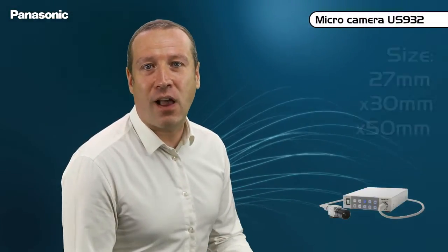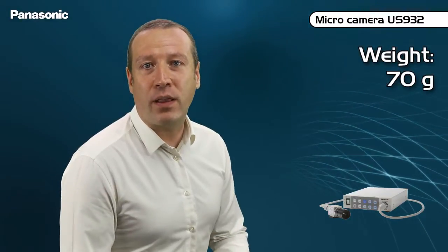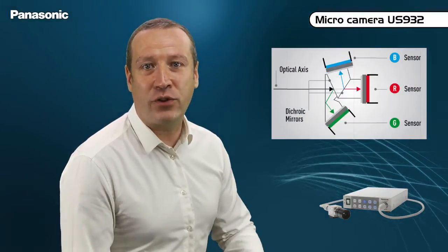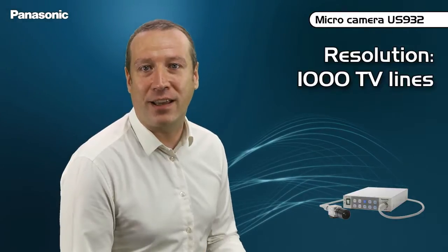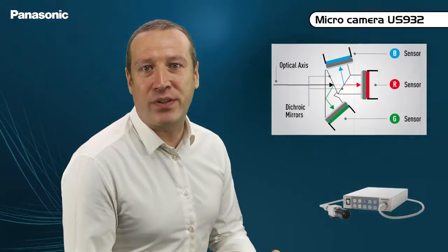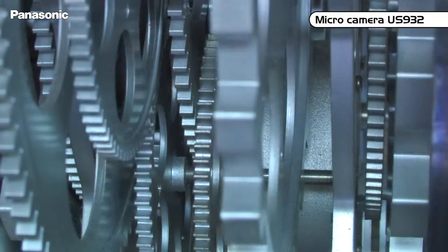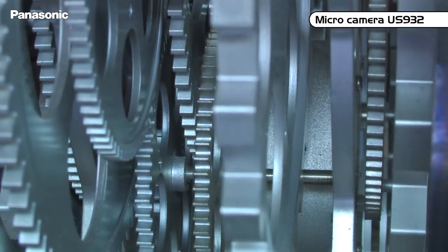The first model is the US932H. This ultra-compact camera head weighs only 70 grams. It is equipped with three 1/3rd type MOS sensors, offering a true resolution of 1000 TV lines. Its standard F11 sensitivity can also be improved electronically, matching professional broadcast cameras. The usage of three red, green, and blue sensors allows precise and accurate color reproduction. The quality of the image is definitely the main asset of this micro-camera.